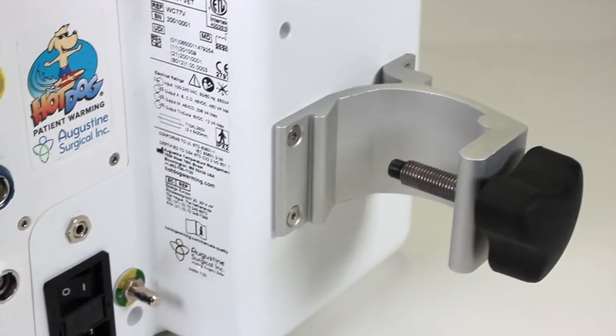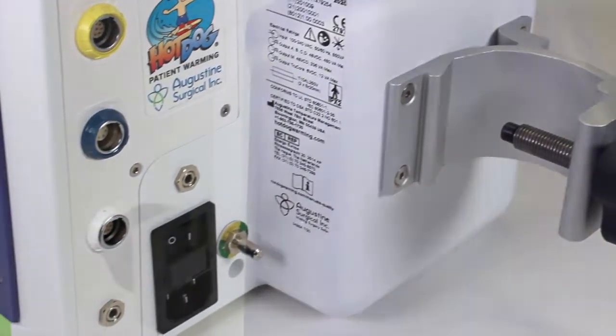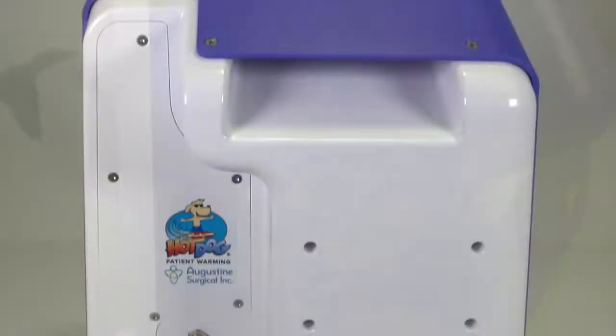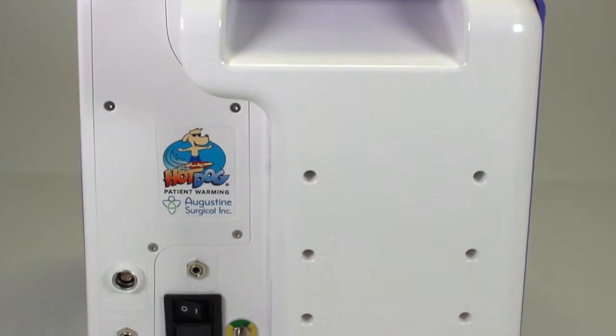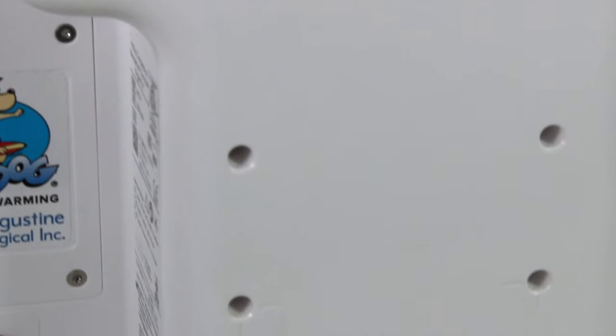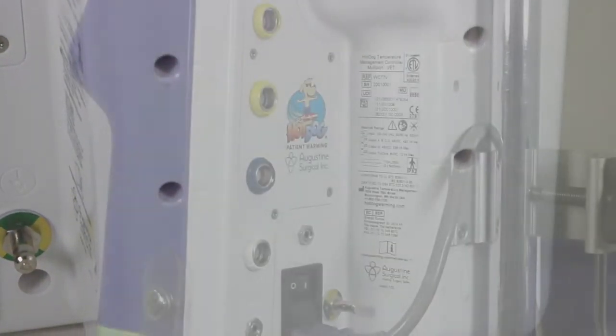Each controller comes with a versatile IV pole clamp that is attached to the controller using a standard VESA 75mm x 75mm configuration. This standard mounting bracket allows the controller to easily be mounted to any compatible components, such as wall mounts or boom arms, if desired.